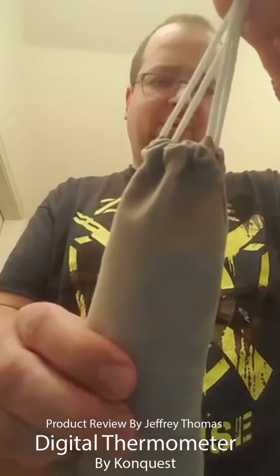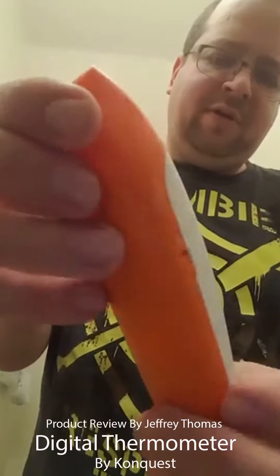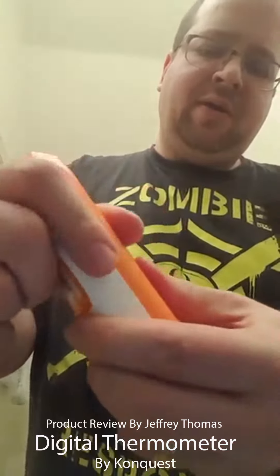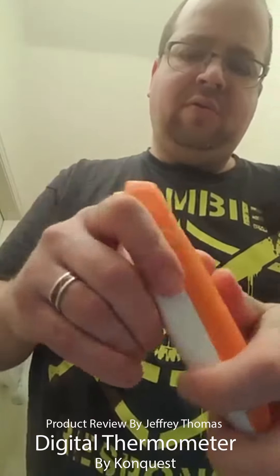It comes in this really cool little drawstring bag, and this is a nice solid unit. Here's the inside of the bag. Here's the item itself — you have your volume, mode, power, and memory buttons. Here is your battery compartment.